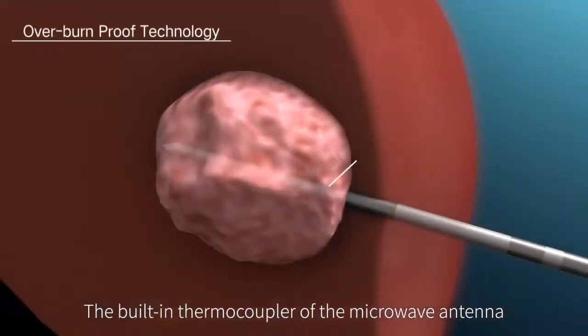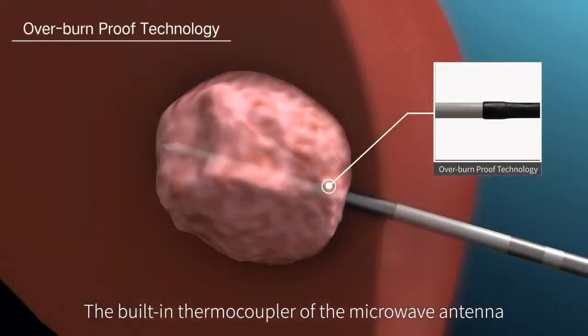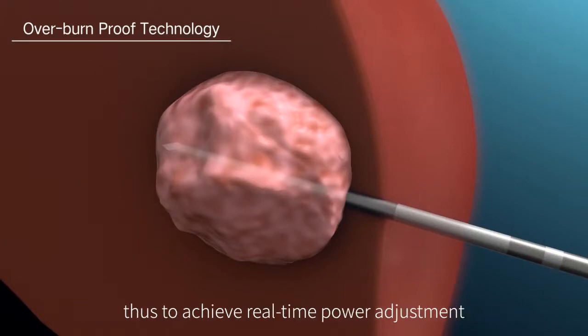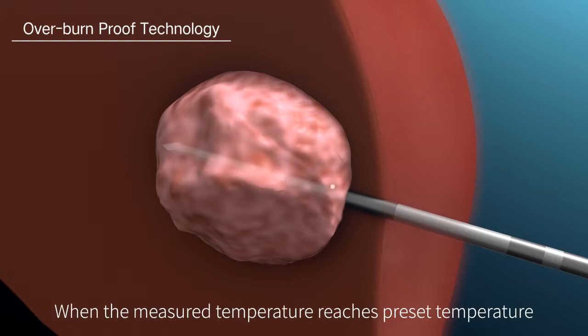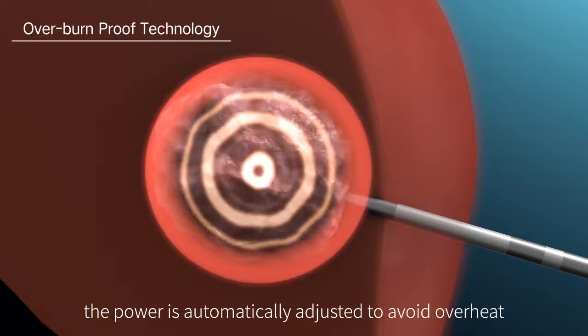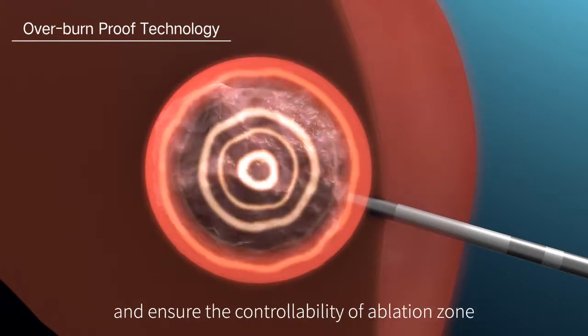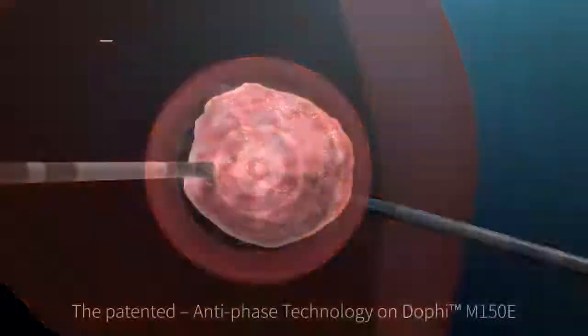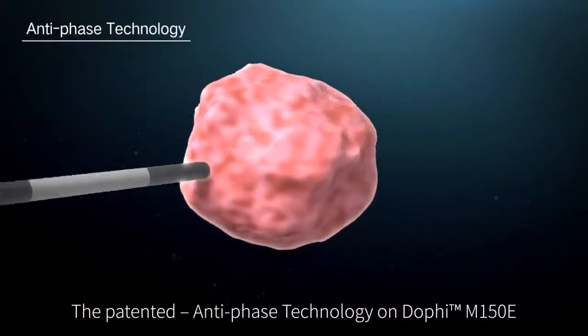The built-in thermocoupler of the microwave antenna monitors the temperature at the edge of the radiation area to achieve real-time power adjustment. When the measured temperature reaches preset temperature, the power is automatically adjusted to avoid overheat and ensure the controllability of ablation zone.